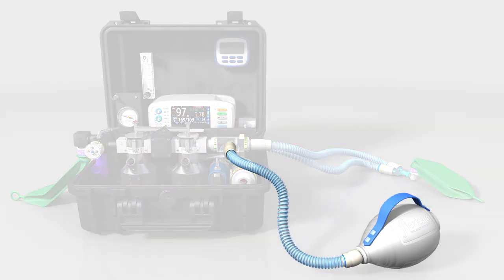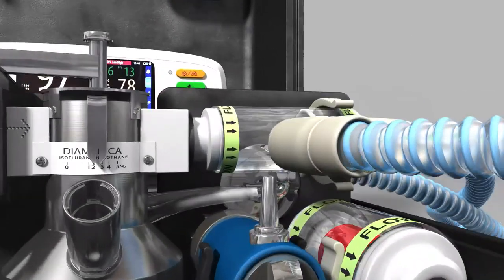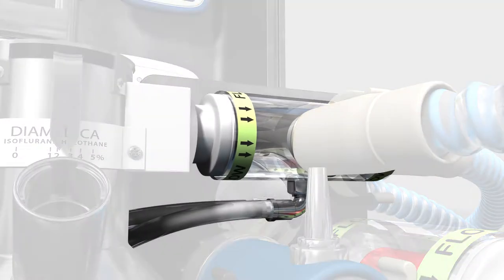The patient circuit valve consists of an inspiratory side and an expiratory side. The two sides are linked by the stabilising tube that transmits pressure during manual ventilation to close the expiratory side, allowing the lung to be ventilated.